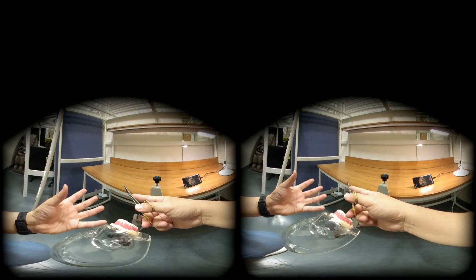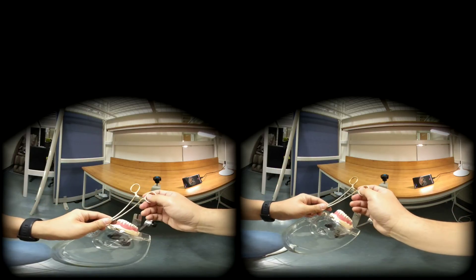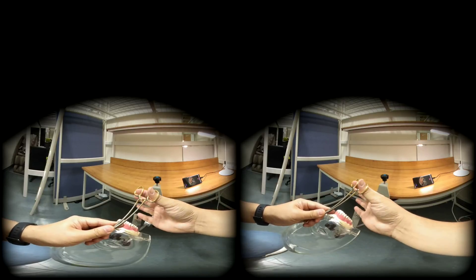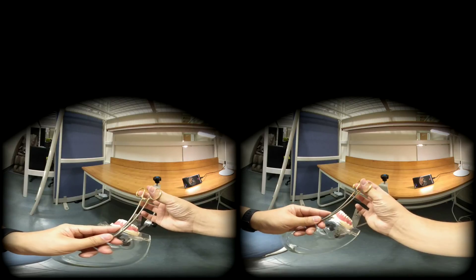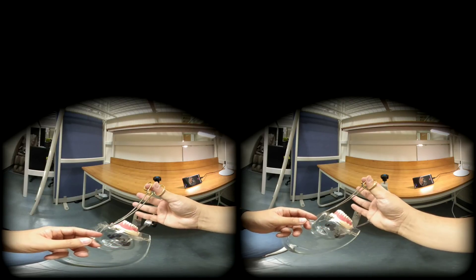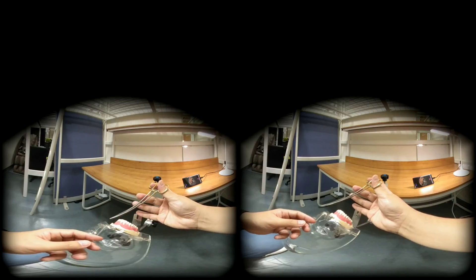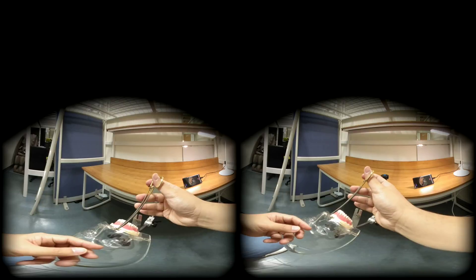So instead of the tripod grip, I highly recommend to use this technique. It is called the reverse grip. Your thumb and index finger — I prefer index finger — go into the rings, and your third and ring fingers provide a rest.